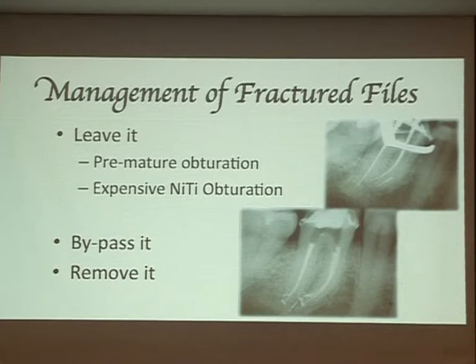How do we manage separated files? Anyone want to answer? Leave it, right? But if you leave it, you need to tell the patient why you leave it, okay? And use a better term in your record: premature obturation, or expensive nickel titanium obturation. Your file is right inside. This is the most conservative. You can leave it, but you need to tell the patient, and you need a reason to support it.